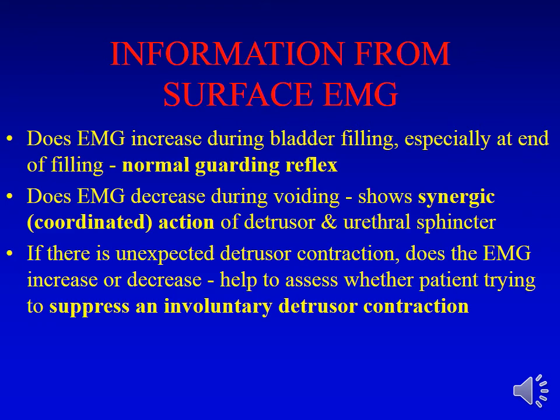Now, if there's unexpected detrusor contraction, sometimes you can unexpectedly during filling phase the detrusor contracts. We need to know whether EMG increases or decreases. This helps to assess whether the patient is trying to suppress an involuntary detrusor contraction or not.